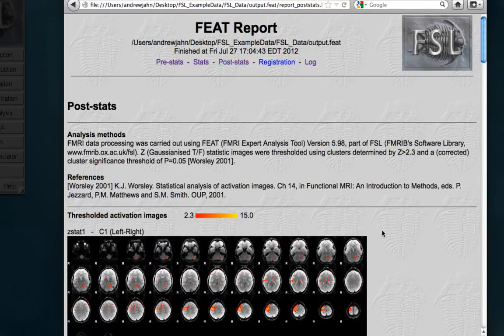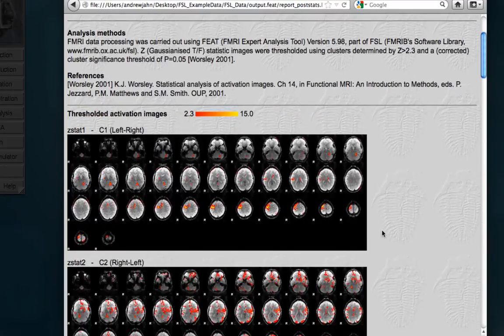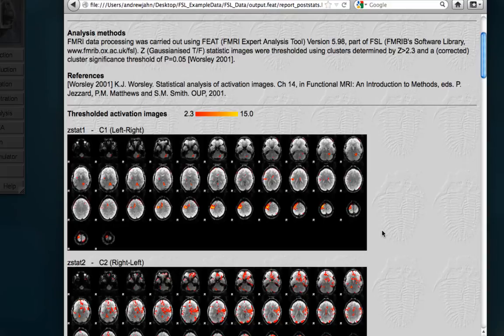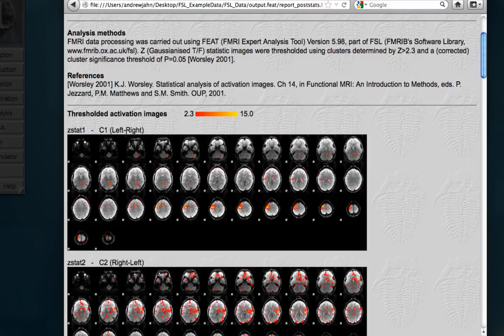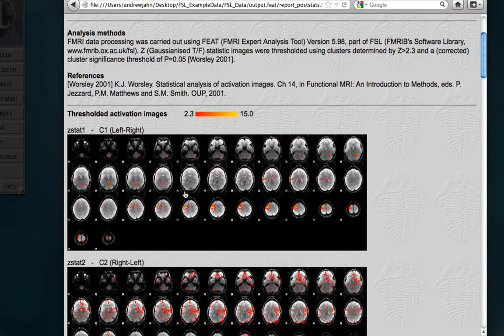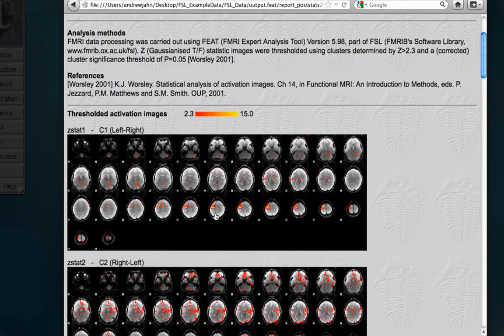Post-stats will show you, rendered on these brain slices, what the different contrasts activation maps look like. So, if you recall before, we said that the threshold we want is only show us voxels that have a Z-score of 2.3 or higher, and that's the lower bound of this heat map here. So, you can see this first one is left minus right, and that contrast produced activation in the right motor cortex, which is what we would expect.